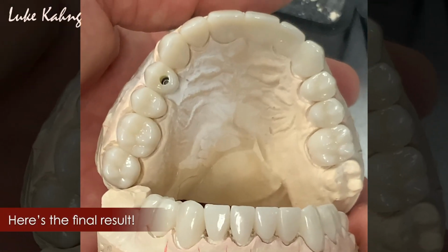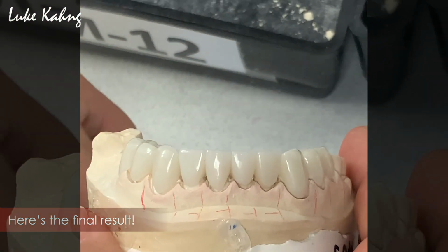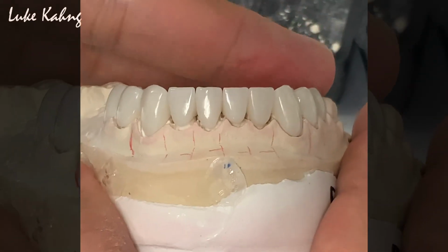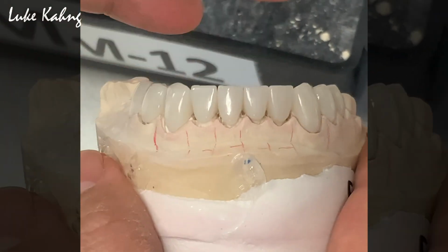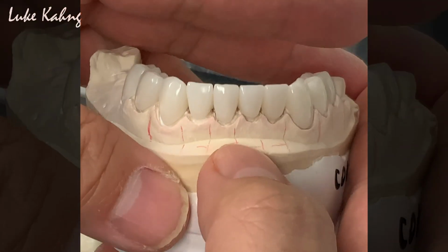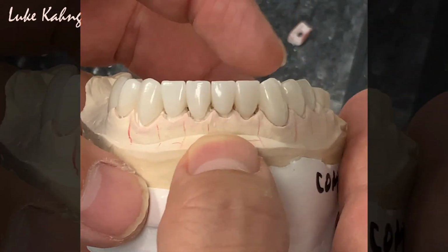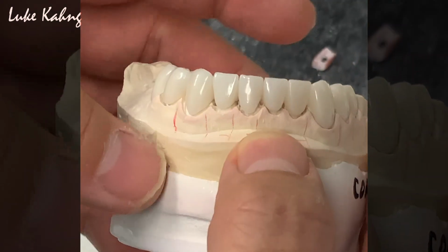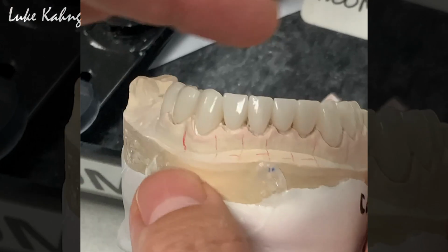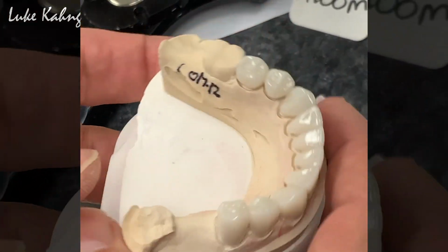As of Friday morning, we finished the full mouth monolithic totally, and then we designed it. Then Joe took the video, which is the serious video about the 9-minute, how to set up the contour from the envelope of function, canine guidance, and then buccal corridor, okay, height of contour, curve of Spee, and curve of Wilson. So that one we finished completely monolithic.